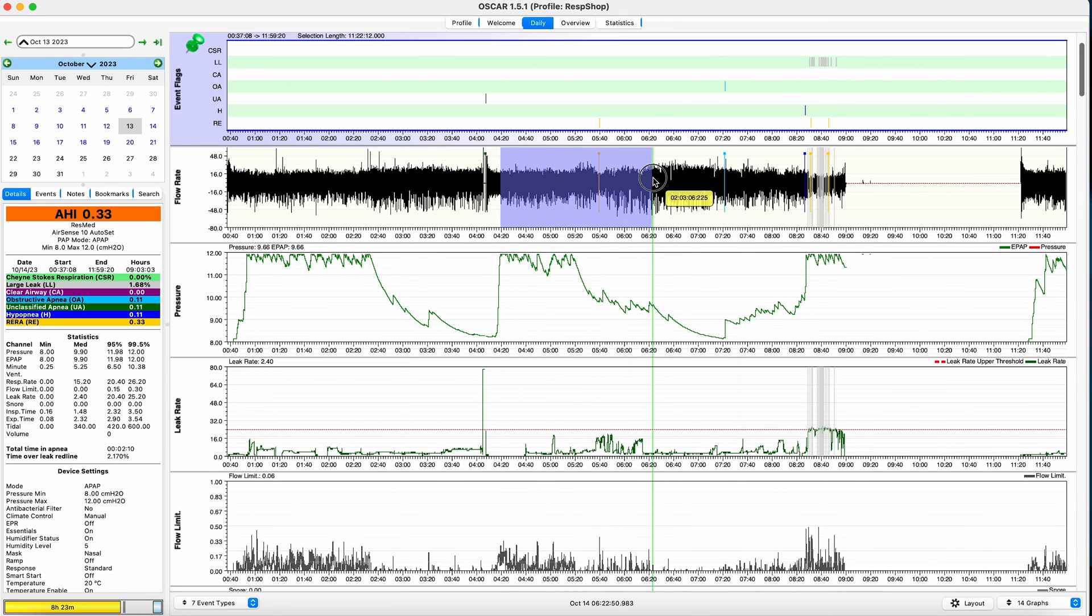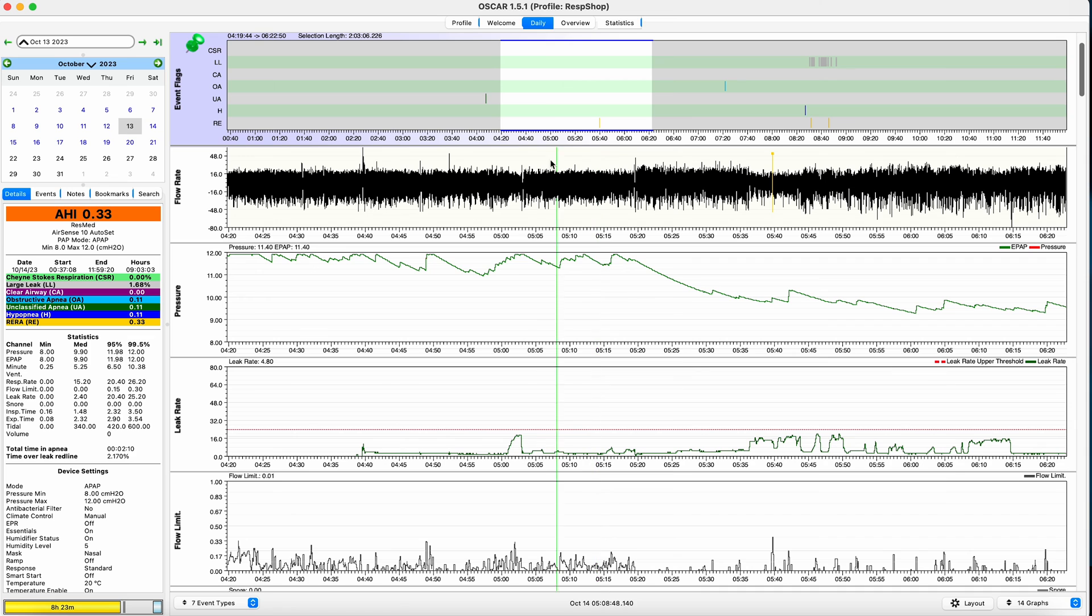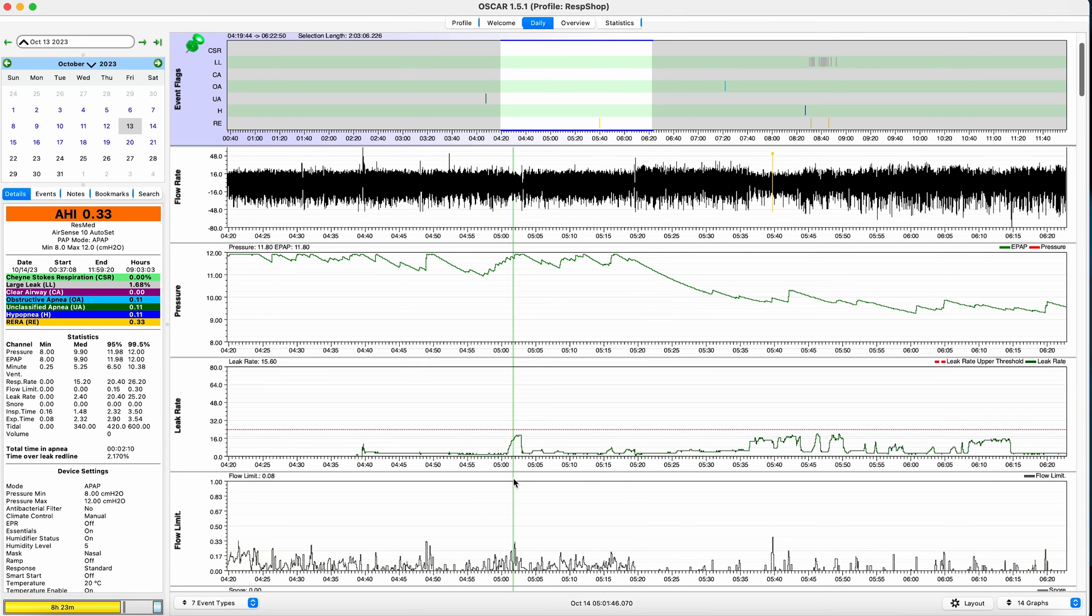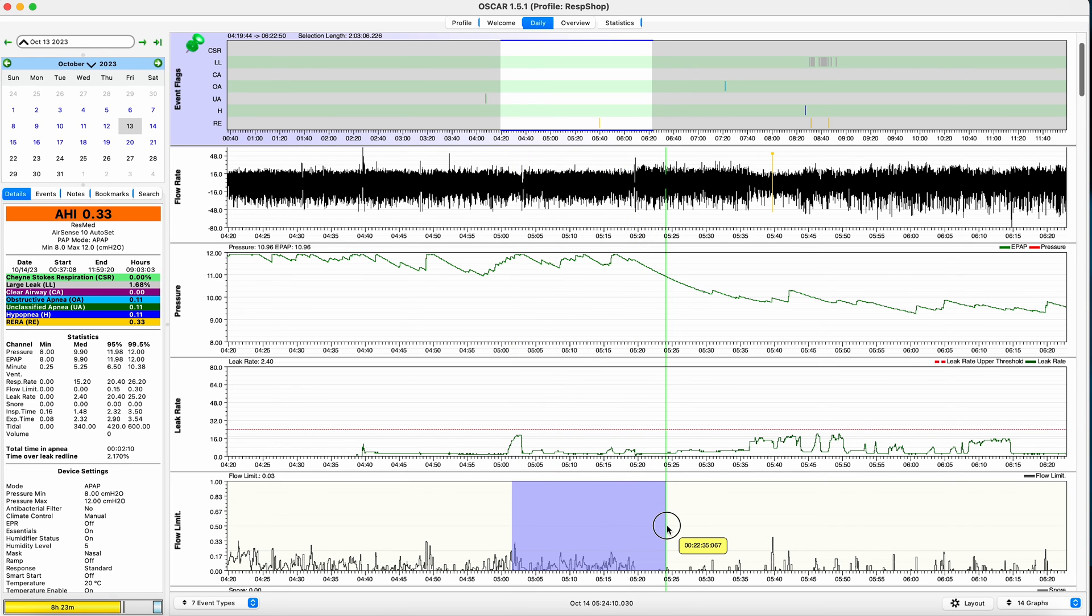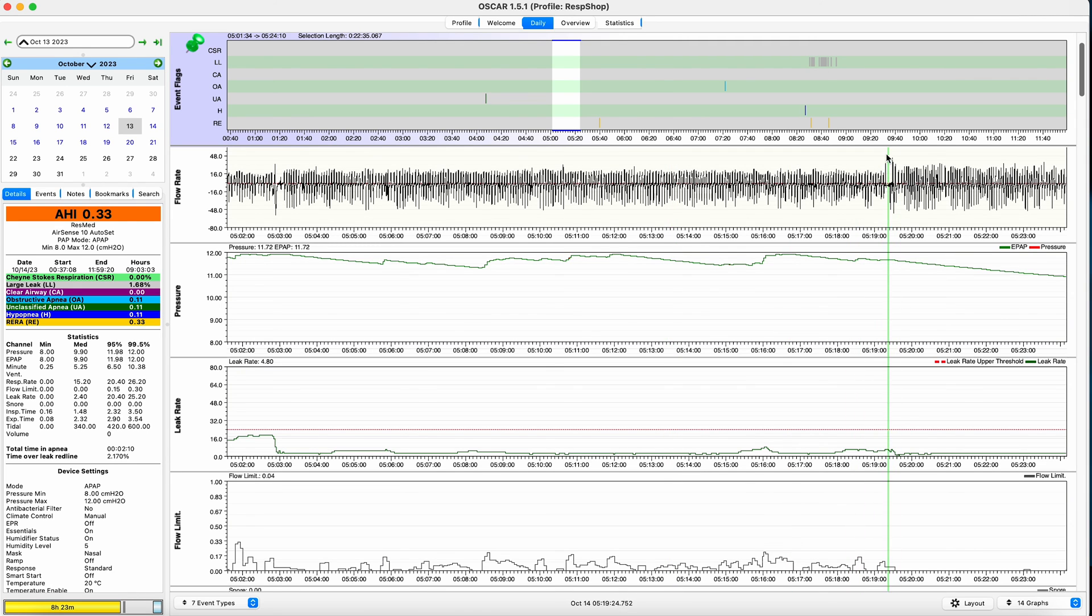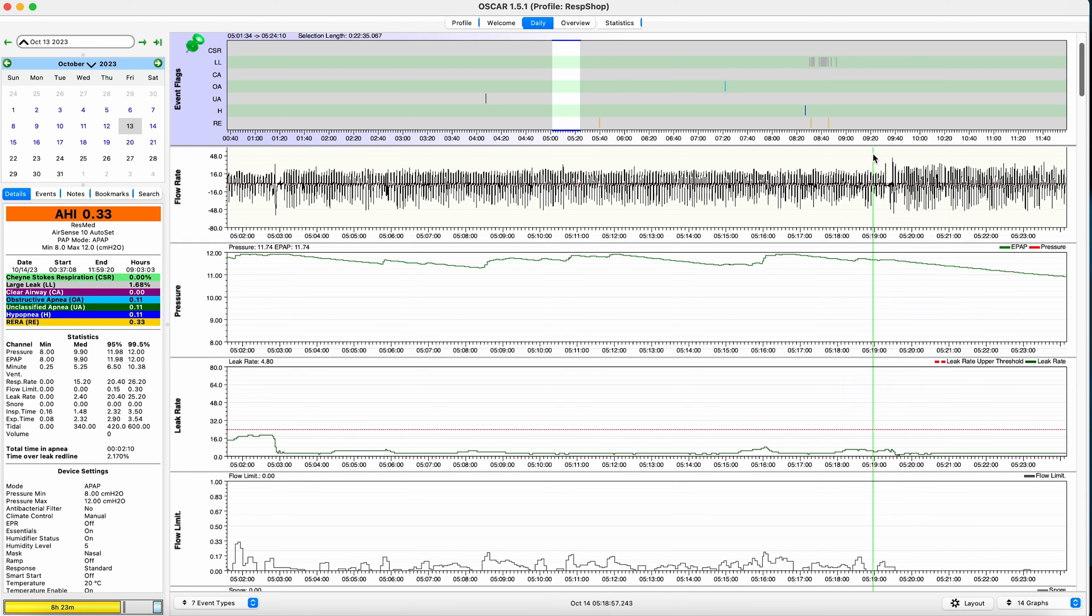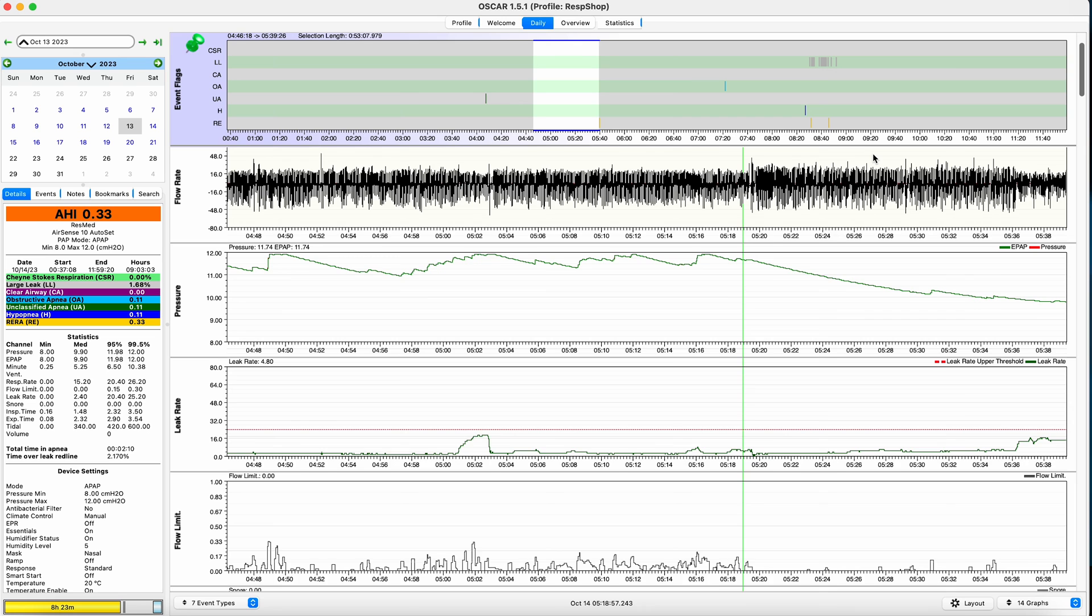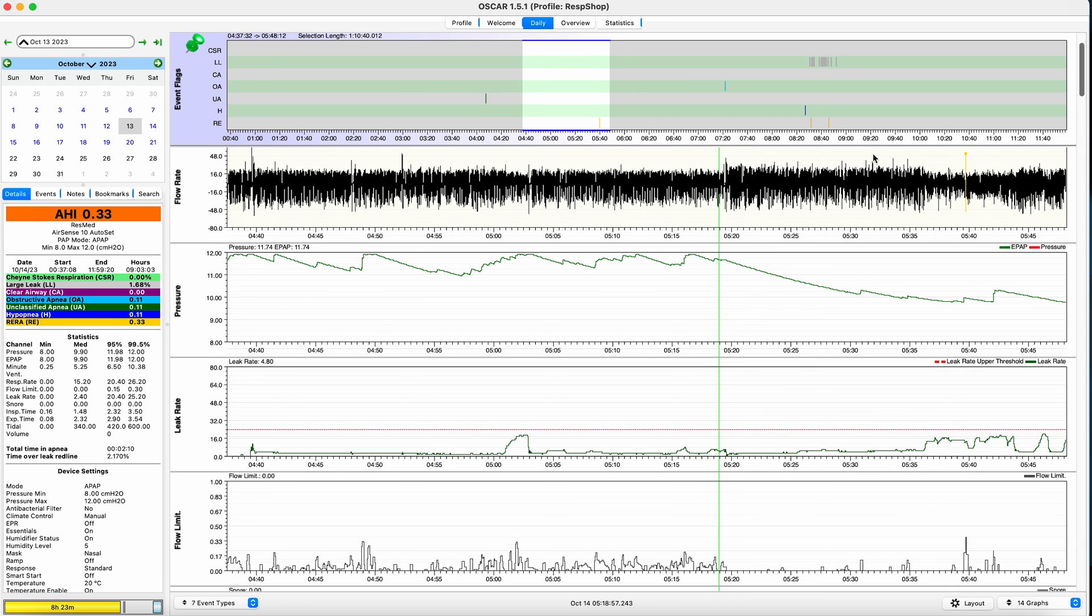What you're looking for is a restriction in the airflow, perhaps coupled with a simultaneous rise in the flow limit track, followed by a short period of stronger arousal or recovery breathing. By looking more closely at your flow rate, alongside some of the other tracks, you can get a better idea of your actual AHI index, rather than just relying on one that the algorithm assigns to you. Checking your data for yourself up close is especially important if your AHI seems low, but you're still suffering from sleeplessness symptoms.